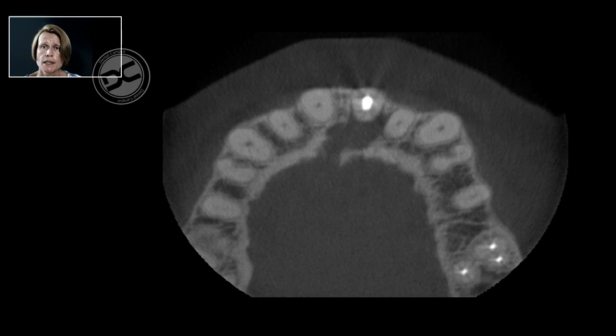Sometimes the canal is also fused with an apical lesion of a tooth that has been traumatized, as is shown here. Thus, such fused lesions may really hamper implant placement, and the use of 3D imaging is essential to avoid any inferior treatment outcome.